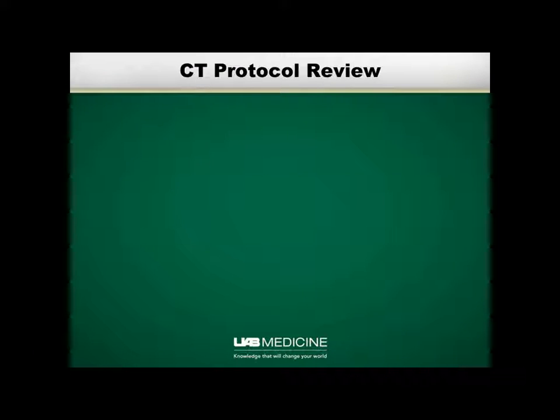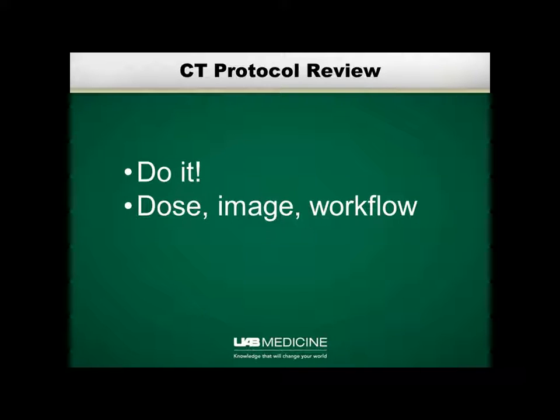Okay, at any rate, I want to summarize the take-home points from this. CT protocol, do it. It's good clinical practice. It's going to improve the efficiency of your department. It's becoming more and more required by regulatory and accrediting agencies. The things to be worried about are dose, image quality, and workflow.